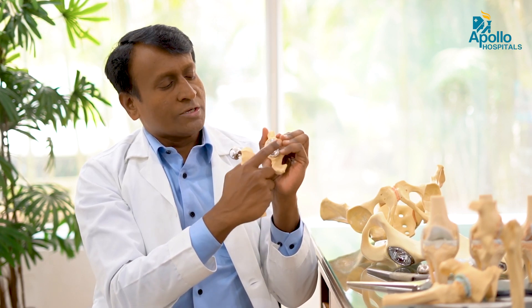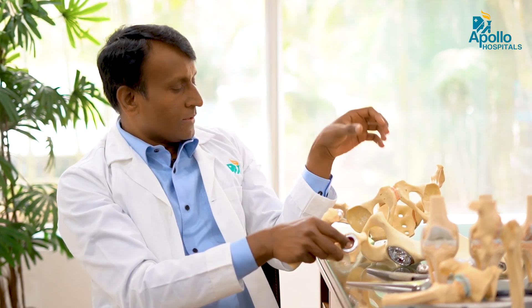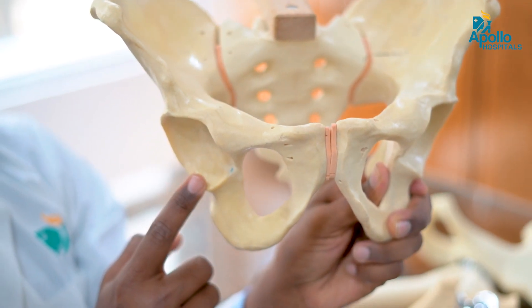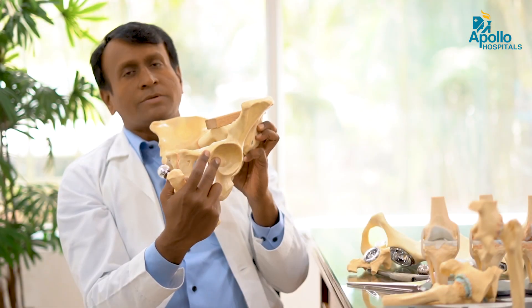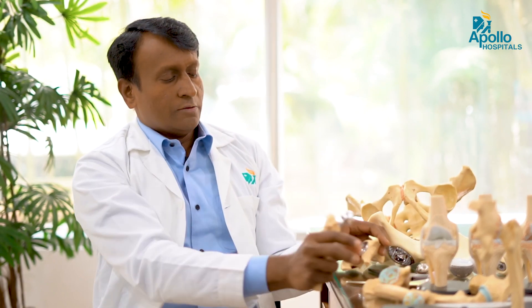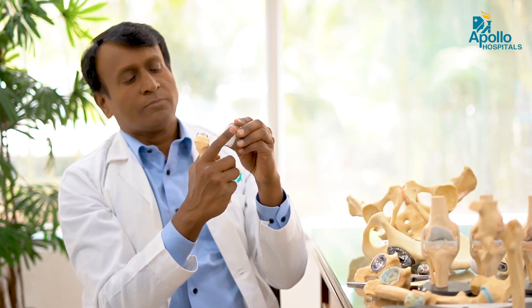The bearing surface is when you put the cup into the acetabulum like this. This is the acetabulum — this is the hip joint. When there is arthritis, the acetabulum is roughened out. So what we do is put a cup like this. This is an uncemented cup where you can see it has a porous surface, and there will be a plastic surface inside it.